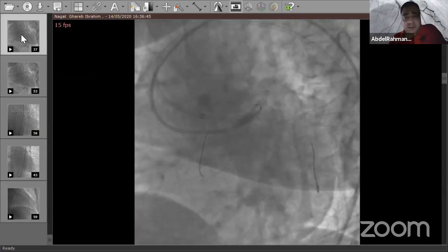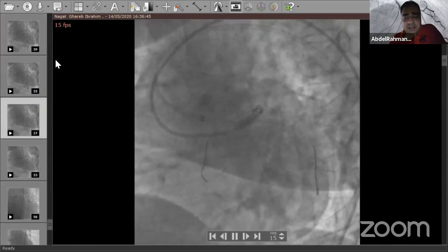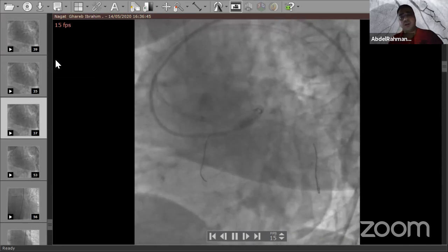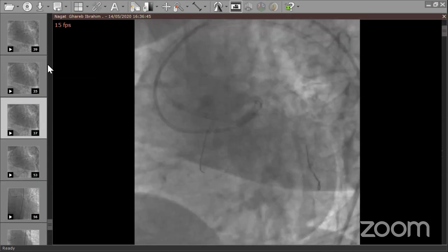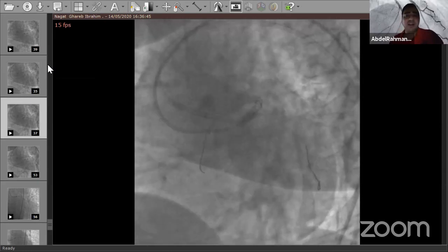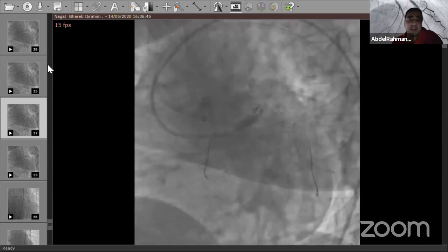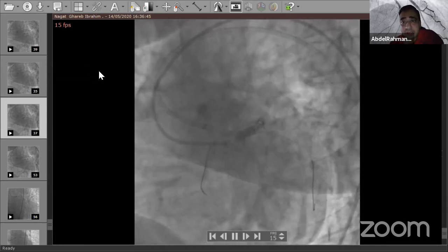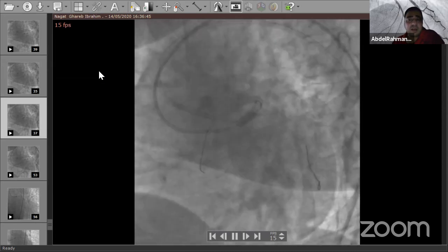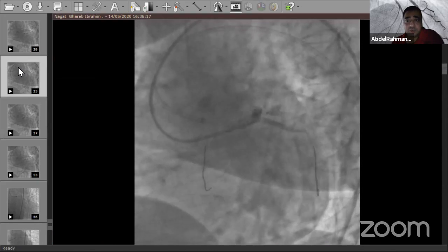Okay. After putting our second stent in the ostial LCX, we do kissing, and as you can appreciate, we have a good angle between the LAD and the LCX. Of course, the LCX is the second side branch here in our trifurcation. So I have done kissing, and I do step POT as I used to do.